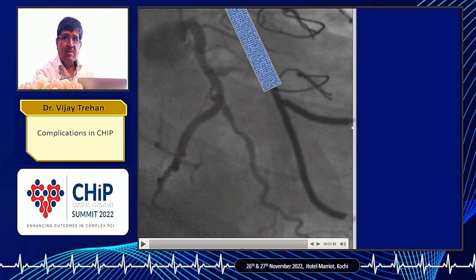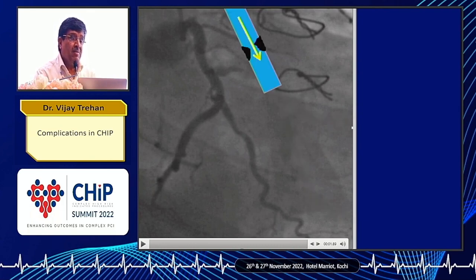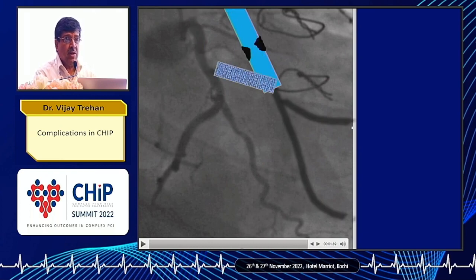But that was on a strong request from the patient that no CTO be attempted, because CTOs can create complications. But otherwise what we should have done is, through this flowing artery, we should have seen the distal vessel and connected retro like this and would have stented like this. That would not have landed us with a problem of vein graft.